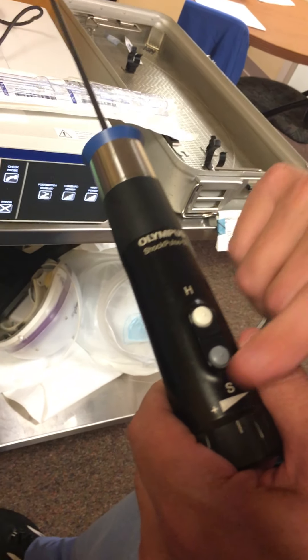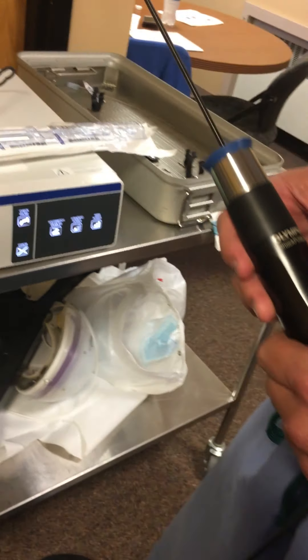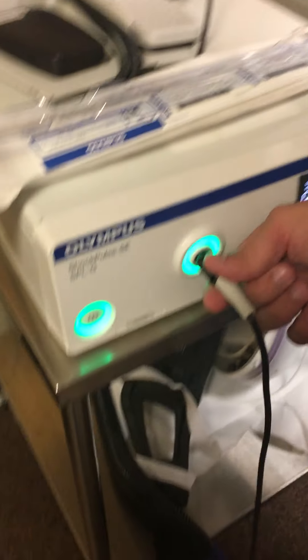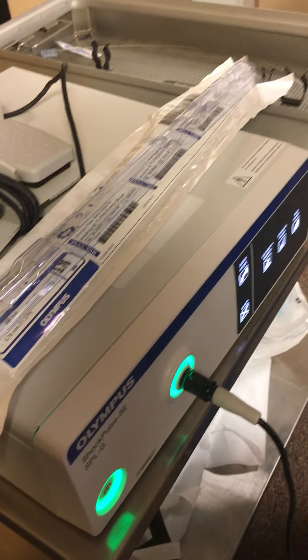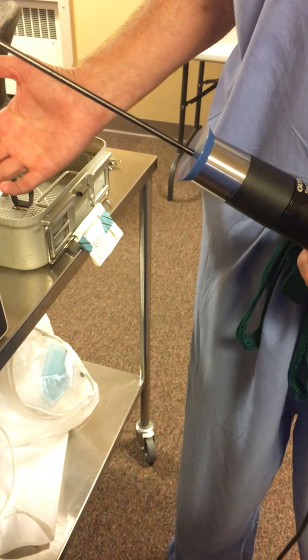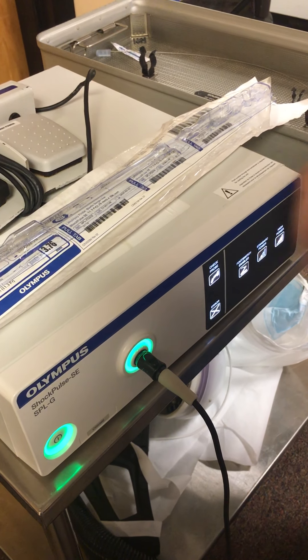To activate from the handpiece, do a double tap — that kicks it on. A single tap will turn it off. You have high power and standard power. If you get a fault or a 'check probe' error, first make sure nothing has come loose. Check the probe to make sure it hasn't become loose or damaged. If it's loose, tighten it and it will be good again. If the probe has broken, replace the probe. It's pretty foolproof and plug-and-play.